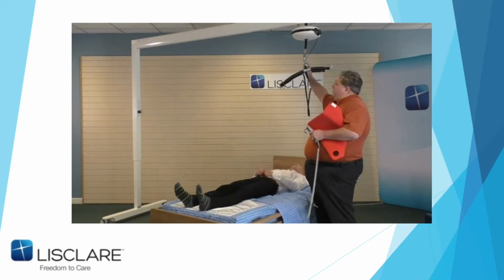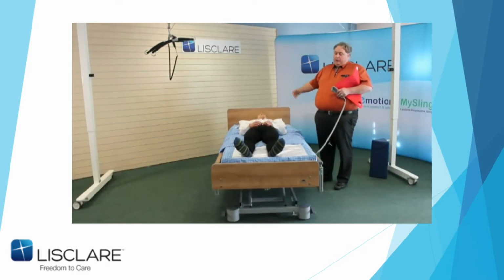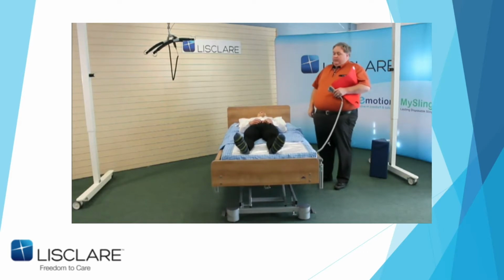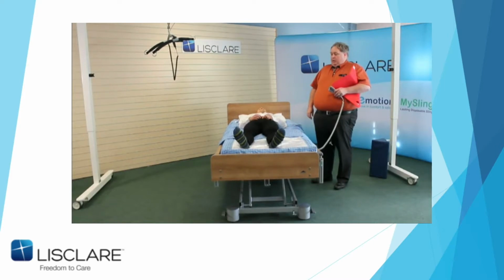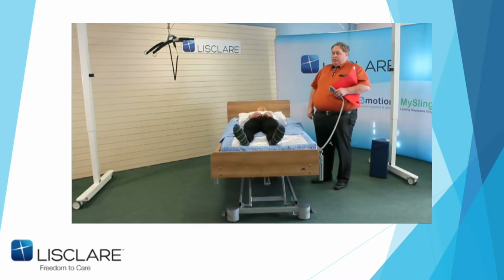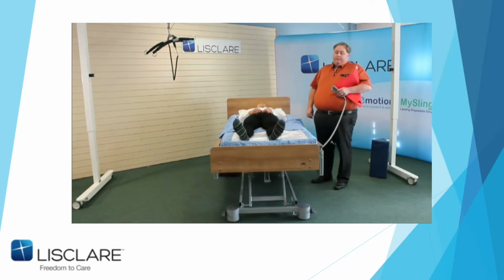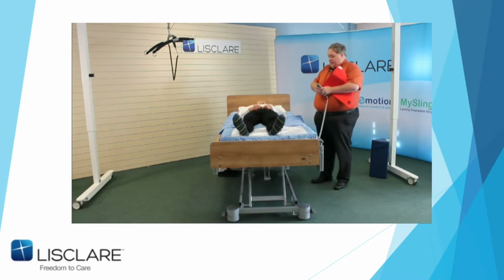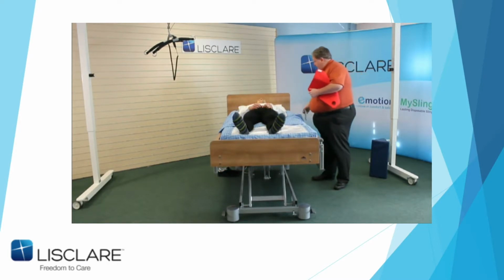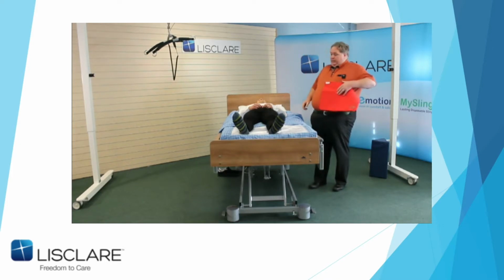Now, as I said, the beauty about the Regalia bed, it drops down low and comes up high. Now, John, like a good lad, has actually got down the bed a bit low. All right? So I'm going to show you a couple of ways of getting John back up the bed first. And then I'm going to actually describe the next stage and why we do things, okay? Again, we've done this quite a few times. So I'm going to start off with bringing John back up the bed, because I might as well, and then try and stop him going down the bed.